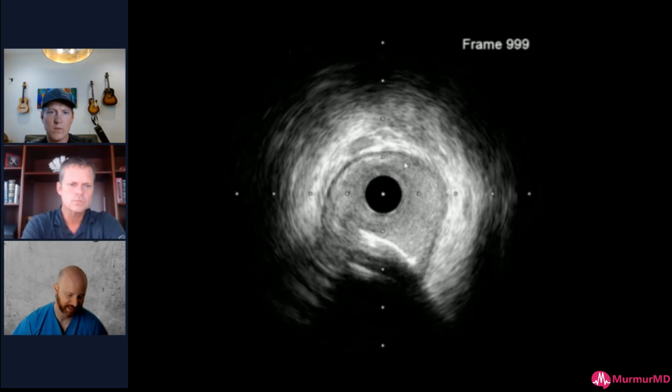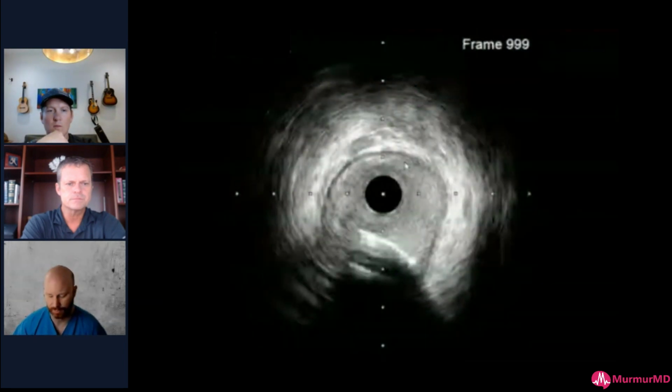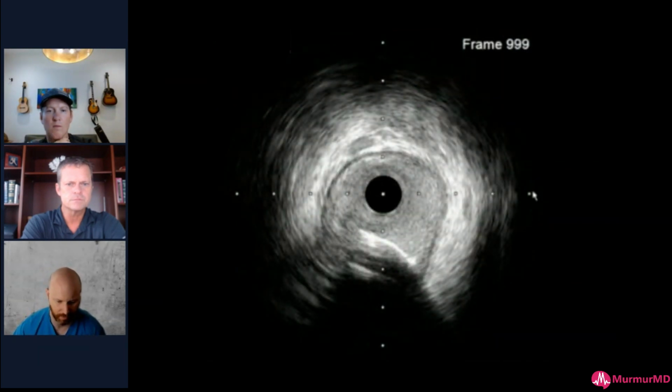So if a vessel like this has a branch that went to the bypassed portion of the lower circ, if I'm going to have to shockwave across that branch and then back, I need a shockwave balloon that touches the walls all the way back to the left main. And so I'm going to need a shockwave balloon that's probably a little bigger than what goes in the more distal obtuse marginal segment. And so I'll just oversize that a tiny bit. So maybe I would have used a 3.0 if I only fix that. I'll use a 3.5. And because it's only 4 atmospheres, there's no real problem there.